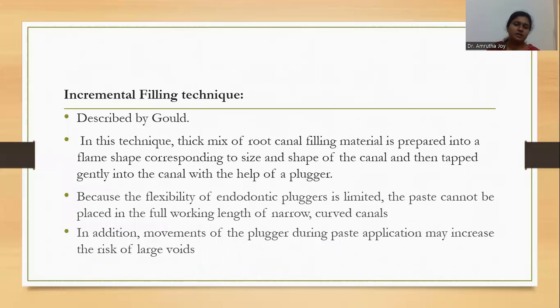The incremental filling technique was described by Gold. In this technique, a thick mix of root canal filling material is prepared into a flame shape, and then it is tapped gently into the canal with the help of a plugger.